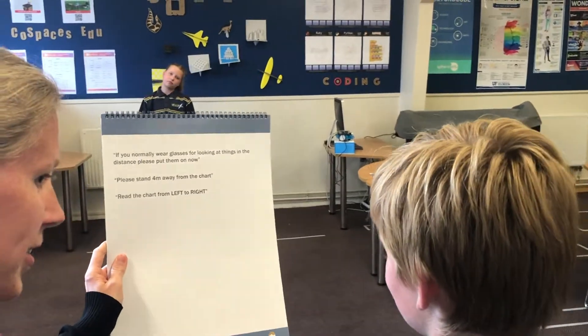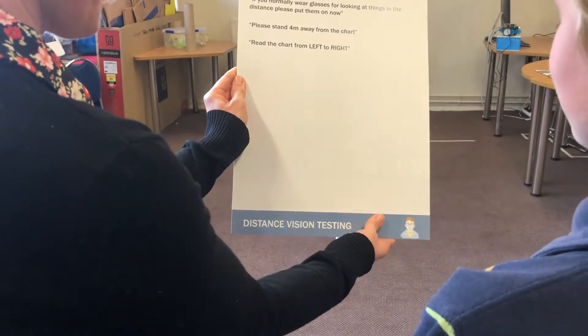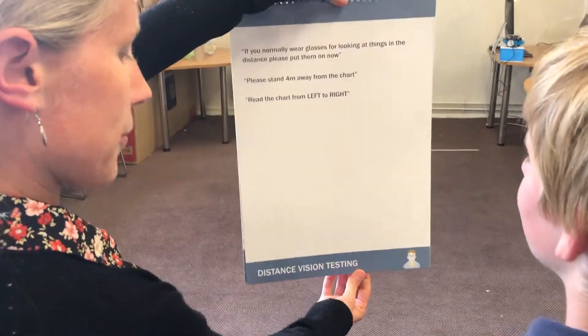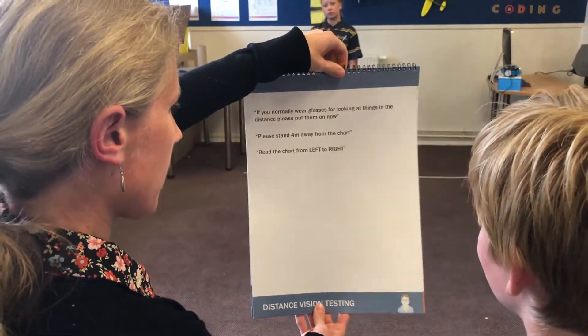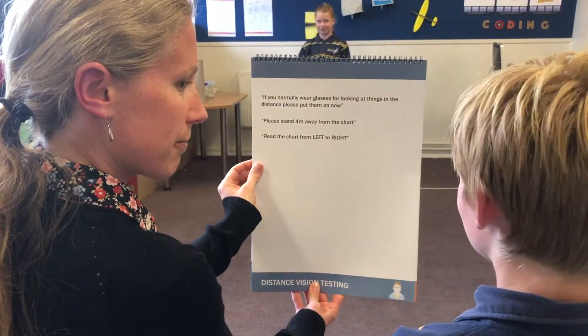Can you see this little face down here? That means the flip chart's the right way around. You're going to hold the chart with one hand at the top and one hand at the bottom, and you're going to read these instructions out to Maddie, who's being tested.